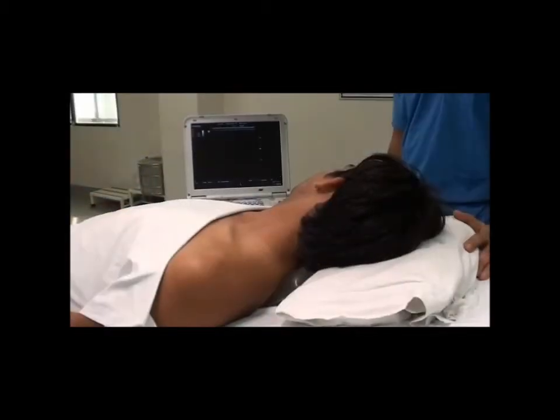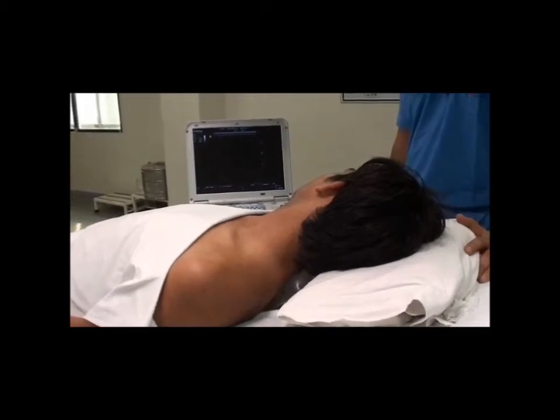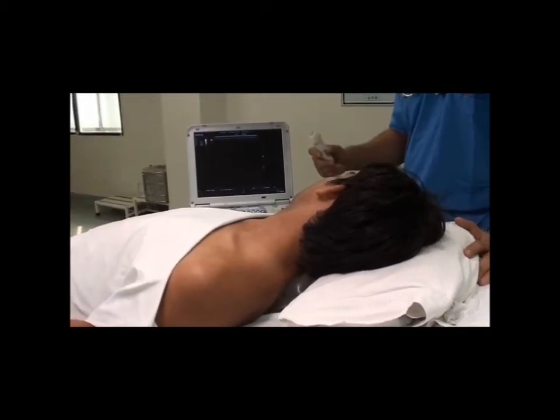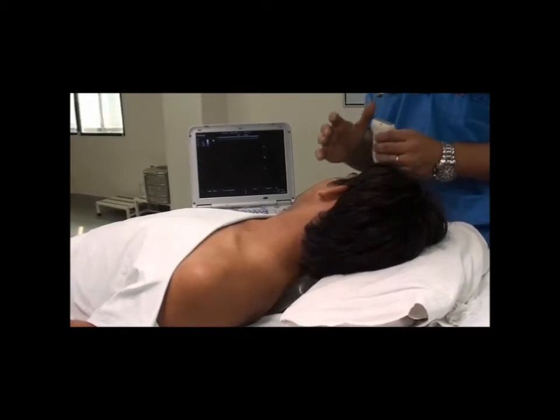Now coming to the choice of probe for supraclavicular block. We need a linear probe in this case because it gives us an excellent picture of near-field nerves.